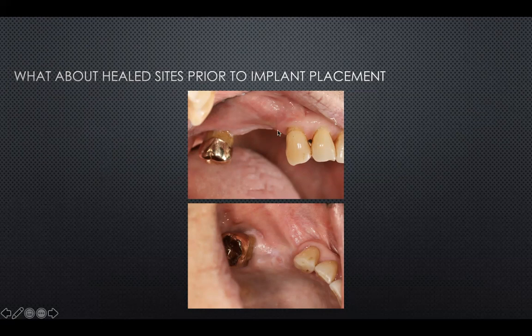There were previous surgeries done here to do a lateral window sinus augmentation, and then ridge augmentation, and because of flap release and flap pull to cover all these bone grafts, we can see the advancement of the mucogingival junction almost to the crest of our ridge.